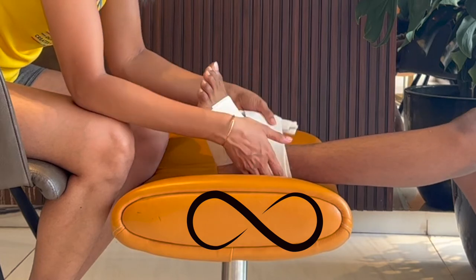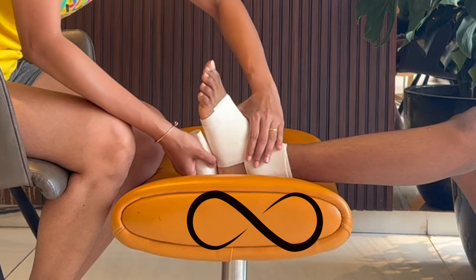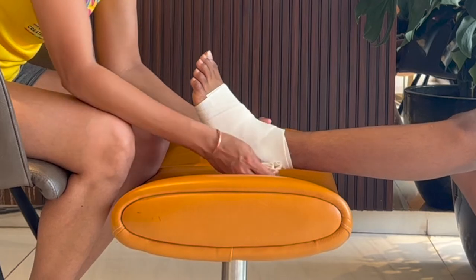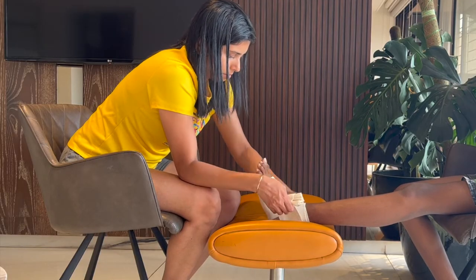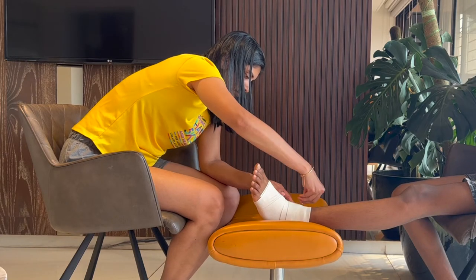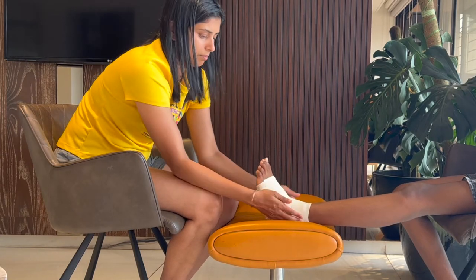Watch closely as this is very important. The wrap goes in a figure of 8 pattern as it goes over the ankle joint then comes below the joint. Keep doing this for 3-4 rounds. As you are wrapping the joint, keep the pressure firm as it will help maintain stability. We'll finish off by applying the clips and a quick check — and there it is.